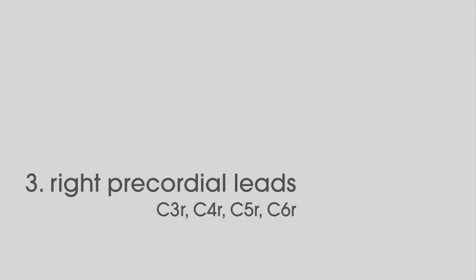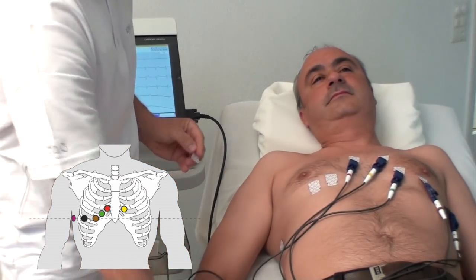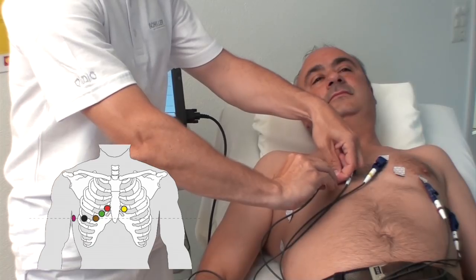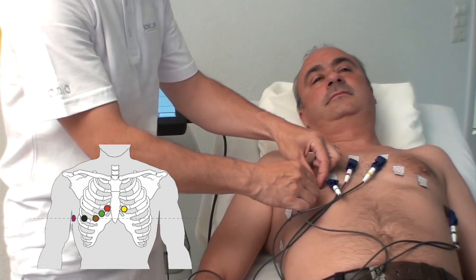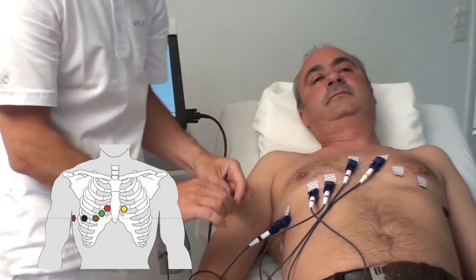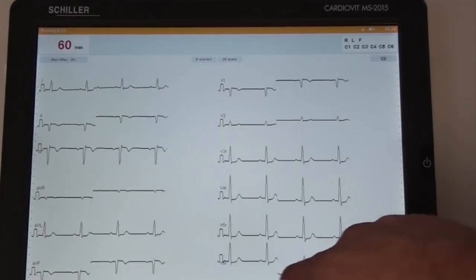Right precordial leads C3R, C4R, C5R, and C6R are recommended in the case of an acute infarction of the left ventricle's inferior wall. The electrodes C3 to C6 need to be repositioned as follows. C3R green, inverted C3. C4R brown, inverted C4. C5R black, inverted C5. C6R purple, inverted C6. Check the ECG signal on the screen and ensure that a good signal is displayed.